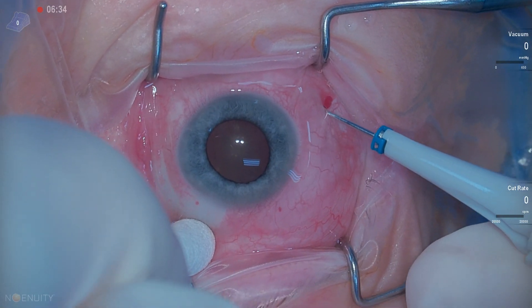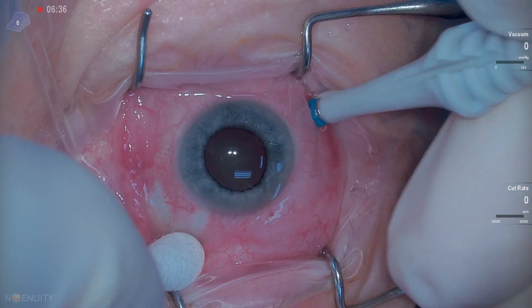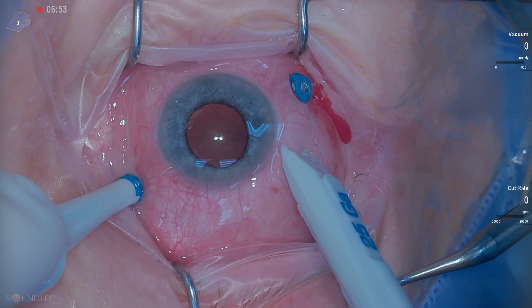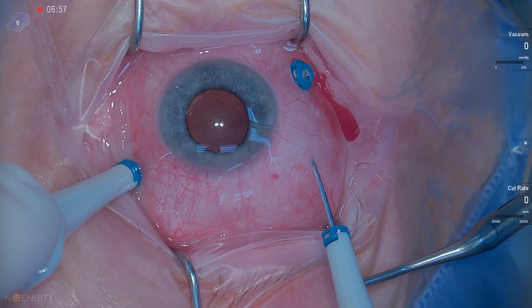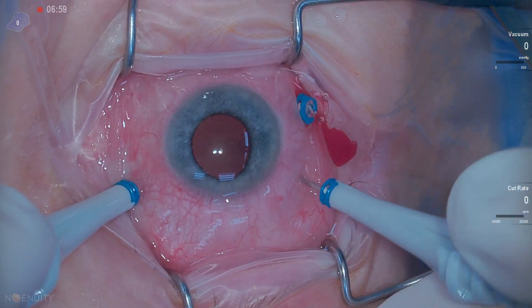This is a primary vitrectomy for retinal detachment repair. I don't use this as often as a buckle vitrectomy, but in the right instances, it works quite well.